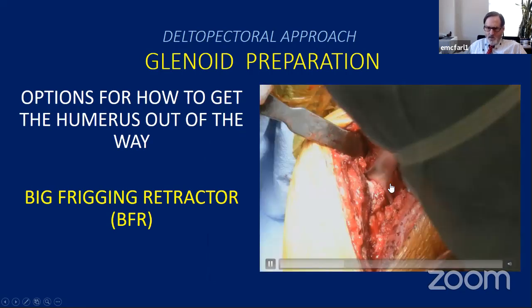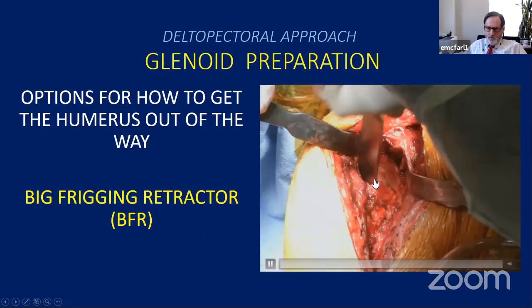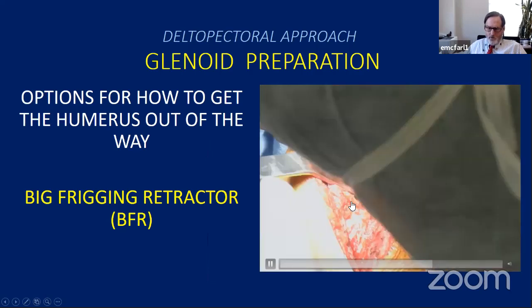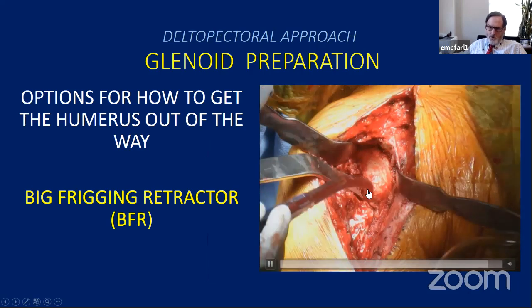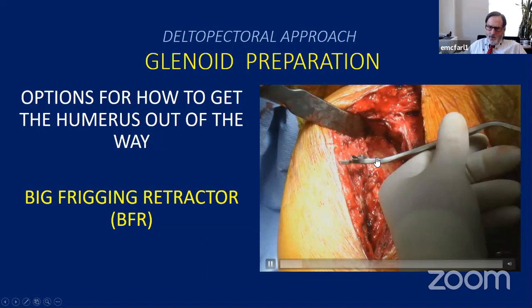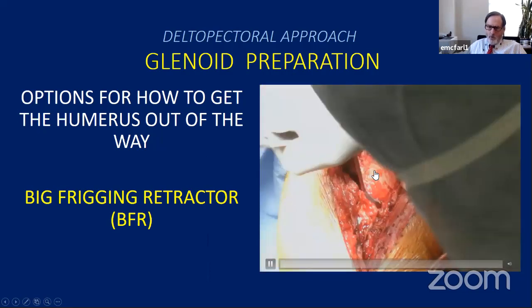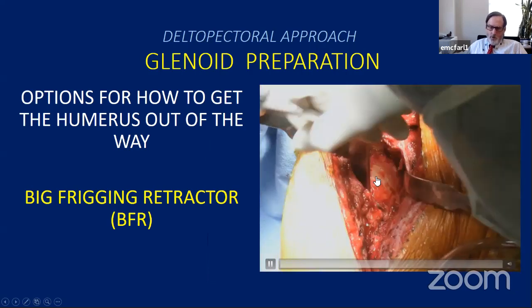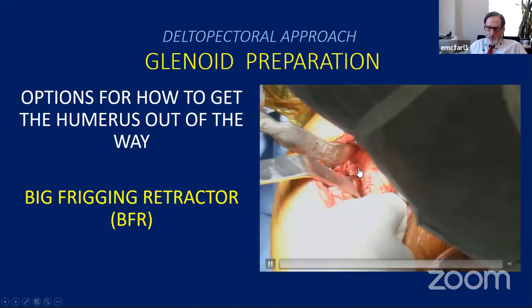So you can put this thing down in there like that. And oddly enough, it works. But one thing you have to do though is make sure you protect the stem and the humerus. It'll smush it or smash it. But see, it gives you really tremendous vision. But the advantage is that the reamers don't hit these tines because they keep it away from the glenoid rim. But anyway, you can experiment with whatever you like to use. But there are special retractors that make it a little bit easier.